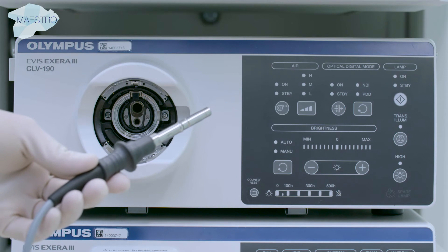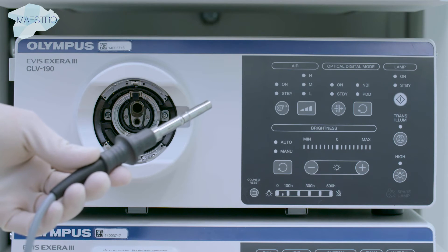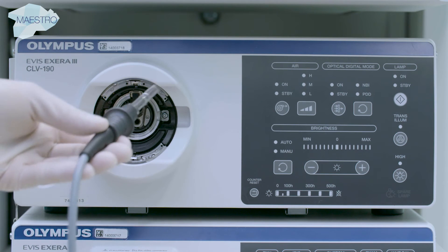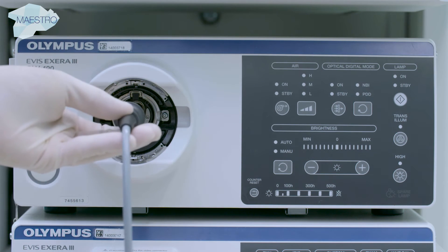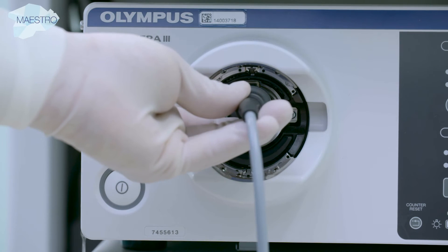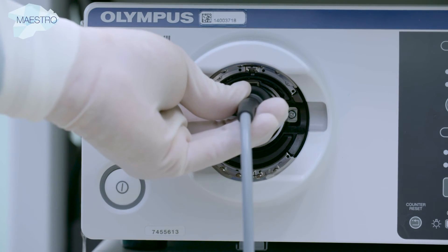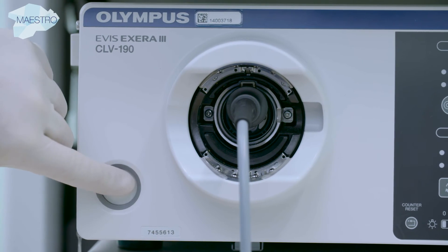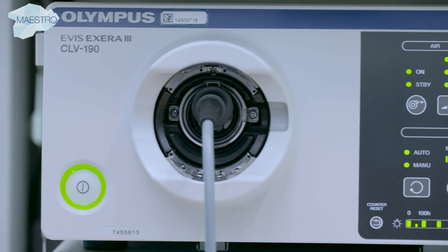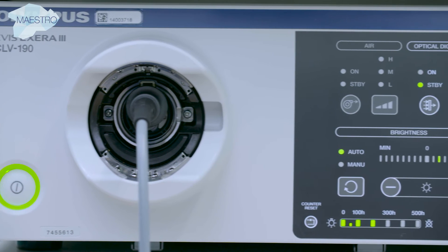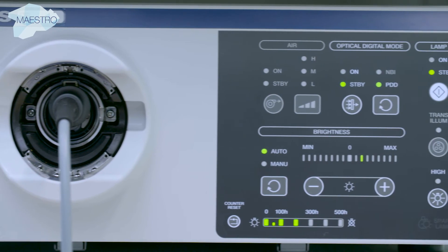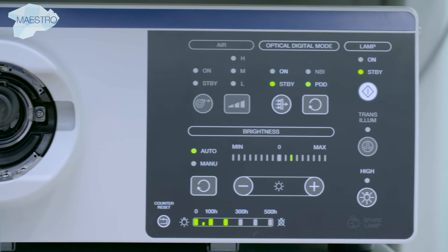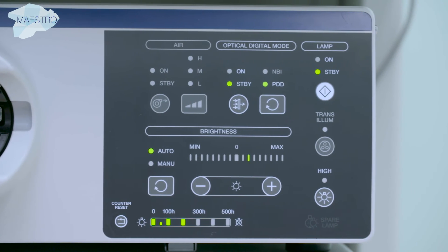The light guide cable needs to be plugged into the universal connector of the light source. The green light indicates that the light source is on. Light settings and special modes can be adjusted using the user interface.